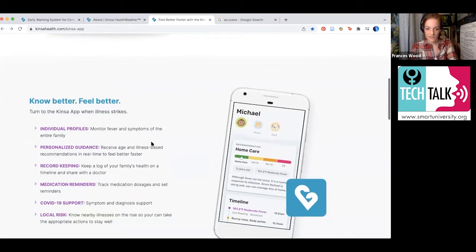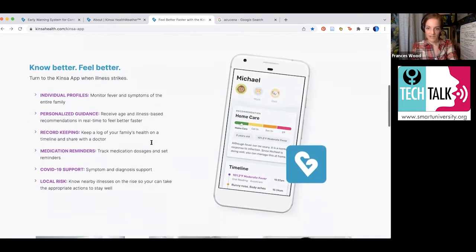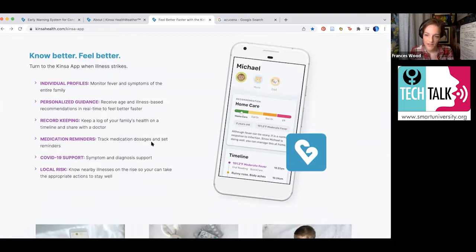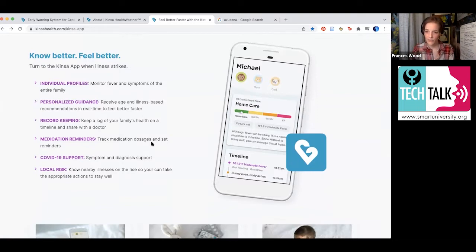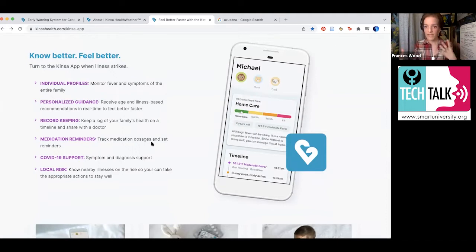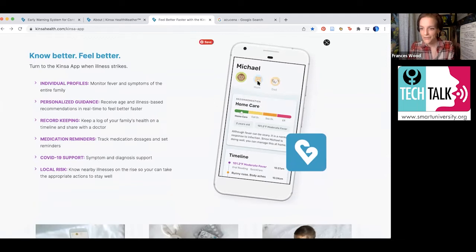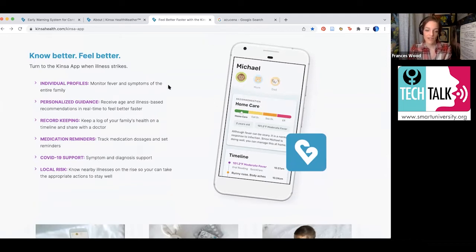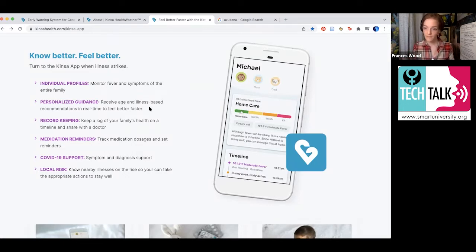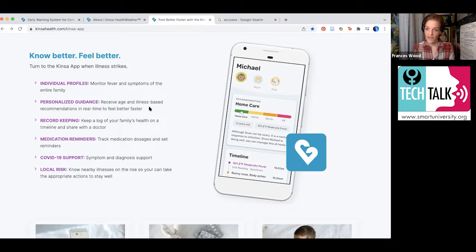Just to give you a sense of some of the things you can do with this: you can have individual profiles for an unlimited number of people. So in your family, you can add many people on here. You give them each a little profile that has an animal that goes with it, which is kind of cute. You get personalized guidance based on your symptoms and your fever.